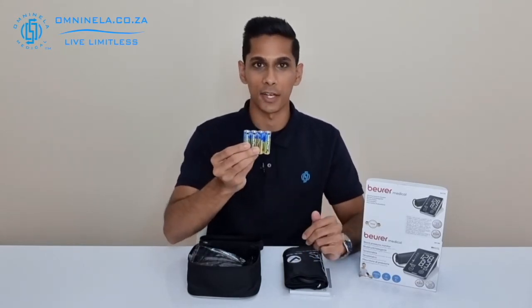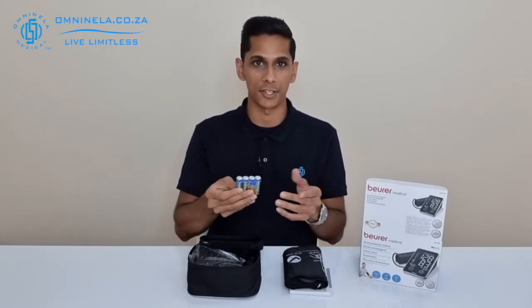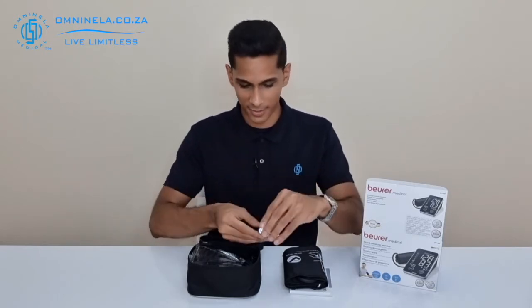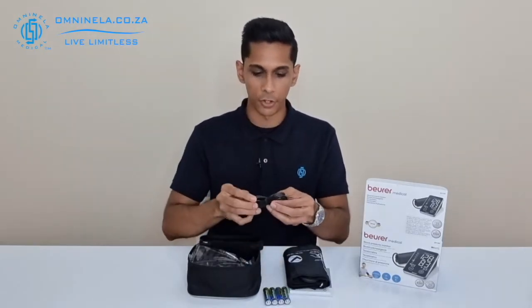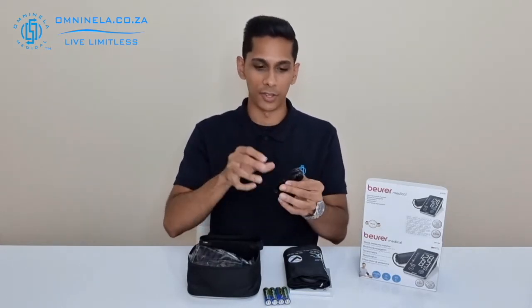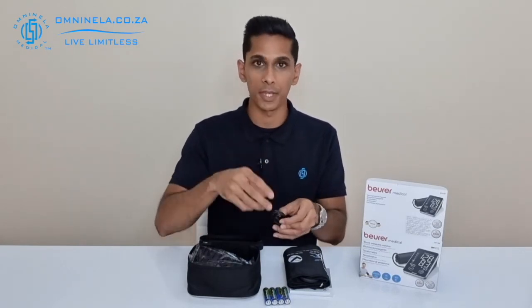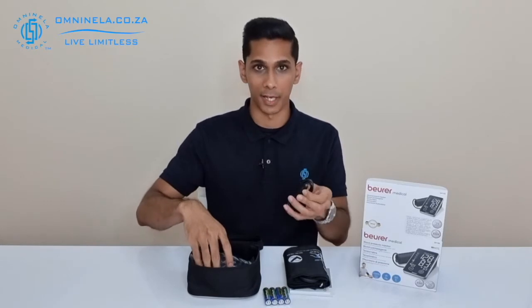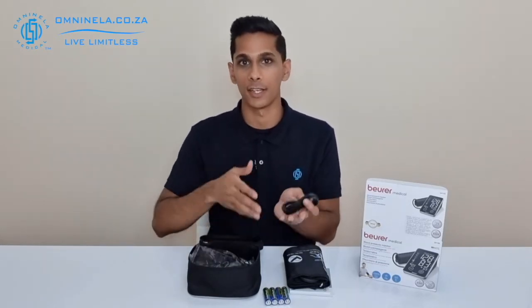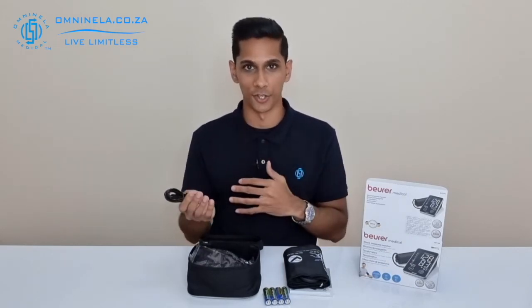If you are going to replace the batteries, make sure you replace them with something like the Energizer Max double-A batteries — they have a good lifespan and good power consistency. Next we have the USB cable that connects from the device to your computer. The application you'll use on your computer is the Beurer Health Manager app, which allows you to transfer information from the device over to your computer to track it or send it to your doctor if need be.